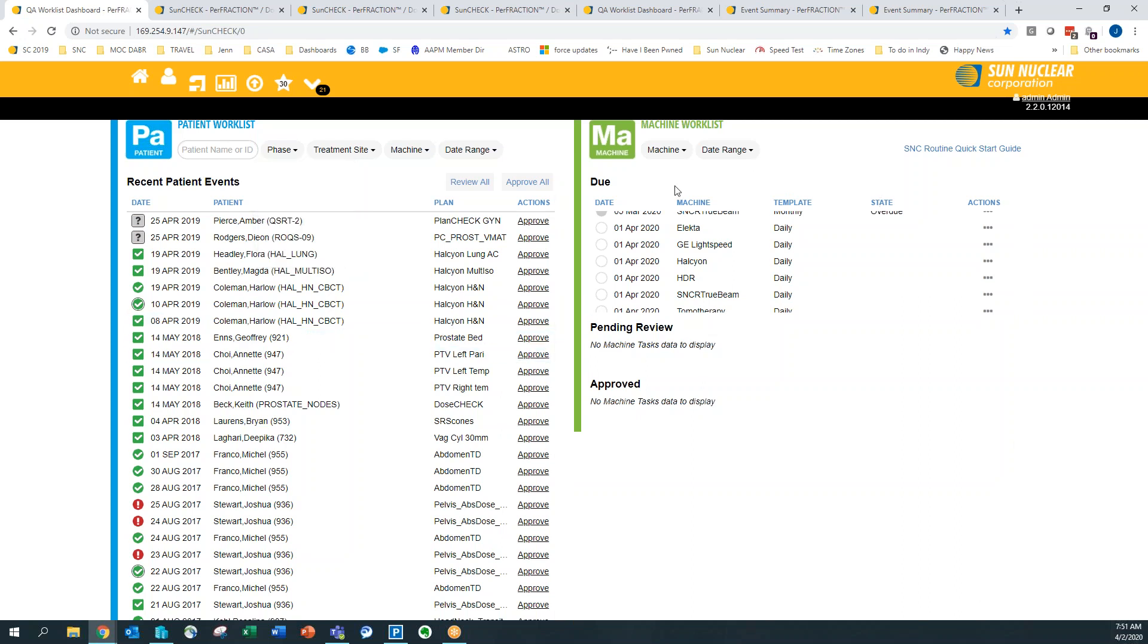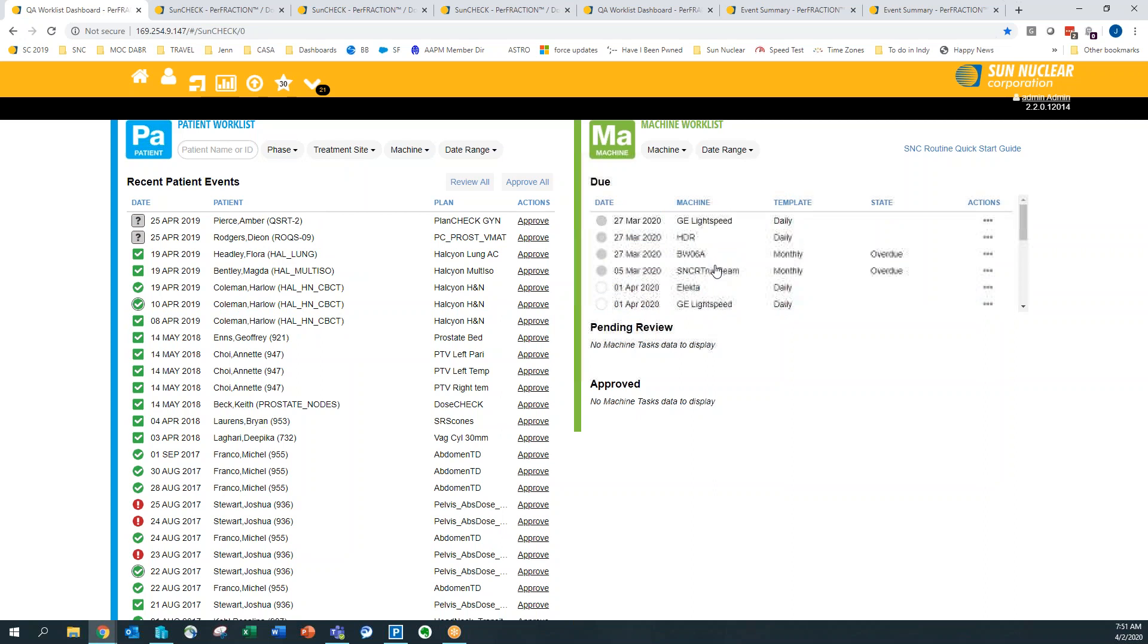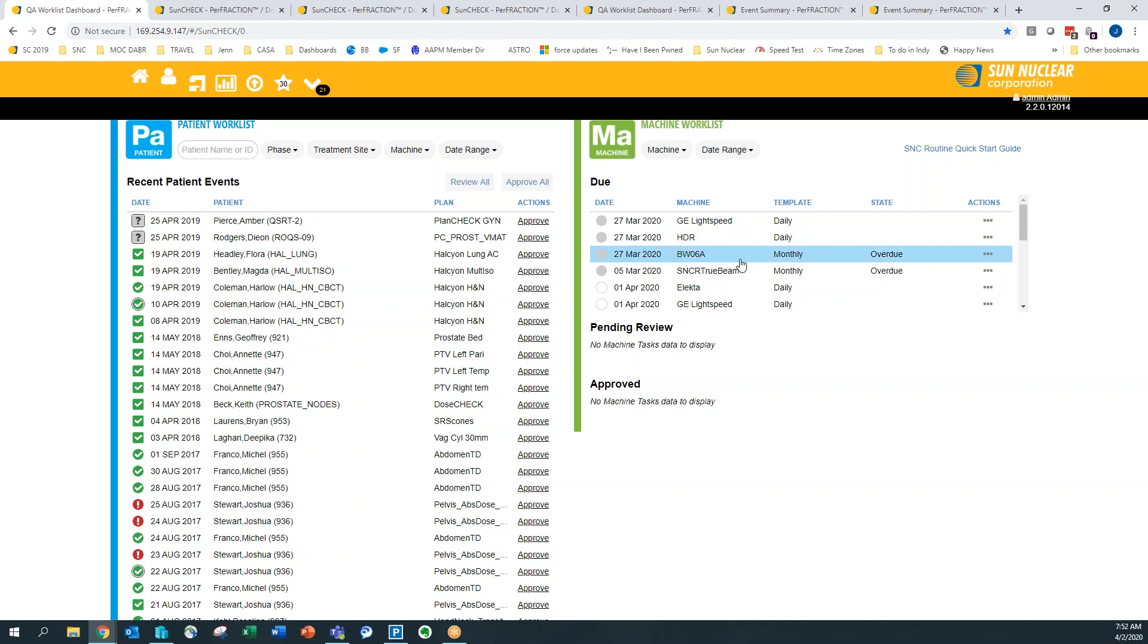And then on the machine side, you can do your dailies, monthlies, and annuals for most of the machines in your department, really all of your machines, because if we don't have a preset template, you can create one for your machine.